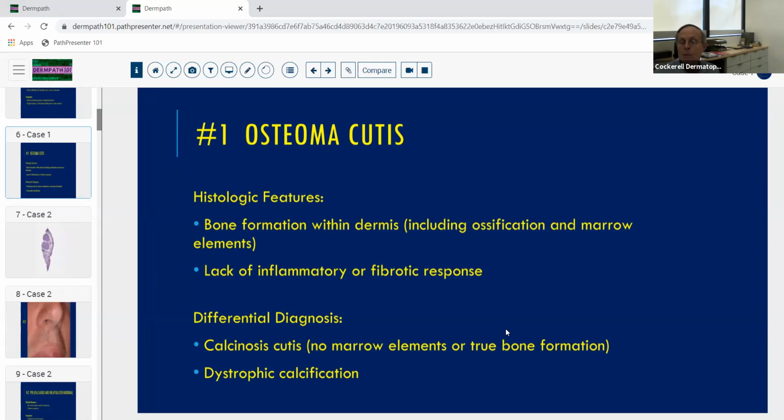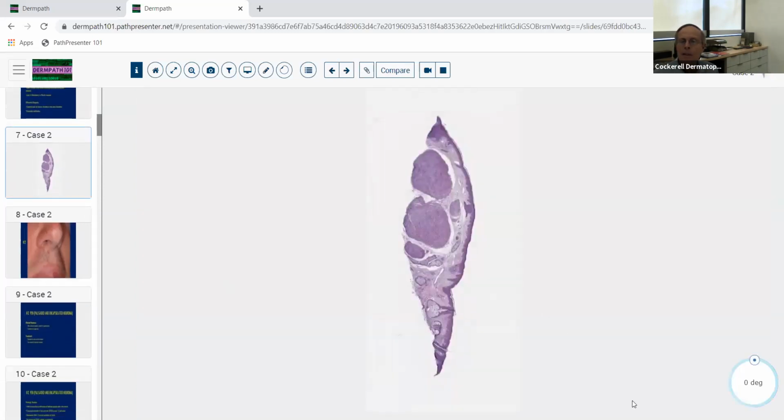Under the microscope, on a board examination, for example, you wouldn't want to misdiagnose that as some type of soft tissue neoplasm or something else. So the osteoclast, osteoblast, the bone marrow, all those various things help you there. The osteoid looks pinkish and a little bit amorphous, but you almost always are going to see some calcification with it too. So that's going to help you if you were thinking about a differential diagnosis of amyloid or something like that.